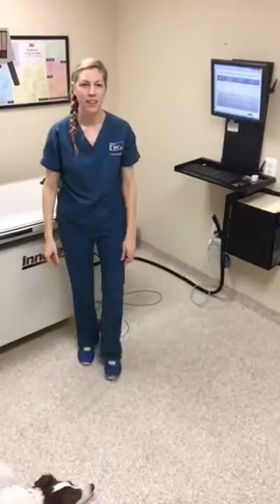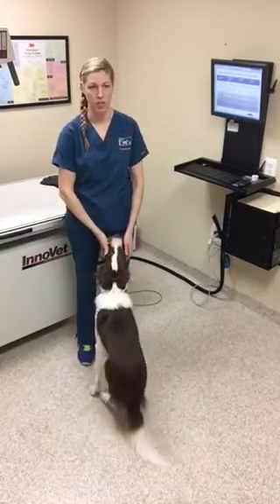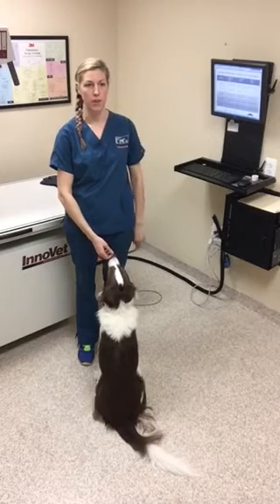Hi, I'm Ashley Gent. I'm a veterinary technician student, and today I will be discussing how to create a technique chart. A technique chart is a table with predetermined settings that enables the radiographer to select the correct machine settings based on the thickness of tissue and the anatomical portion of the body to be radiographed.